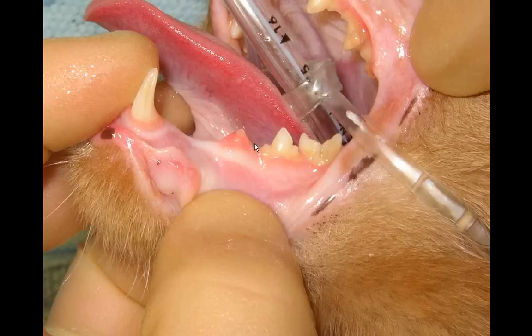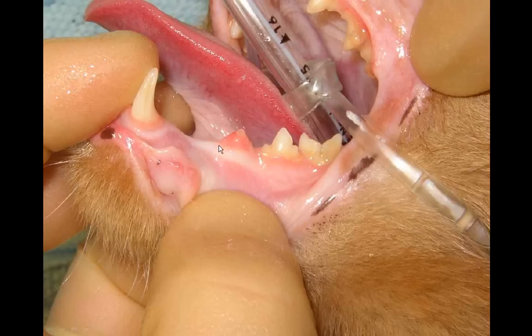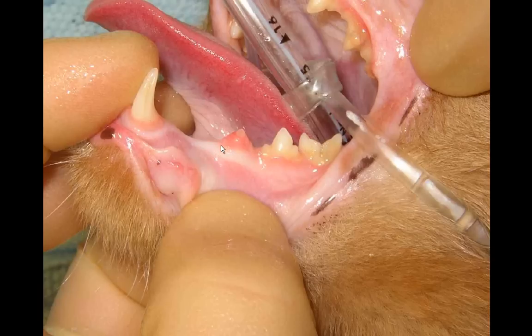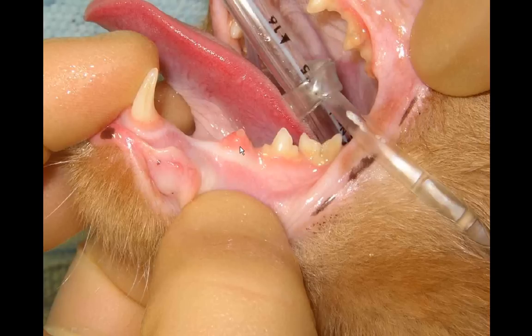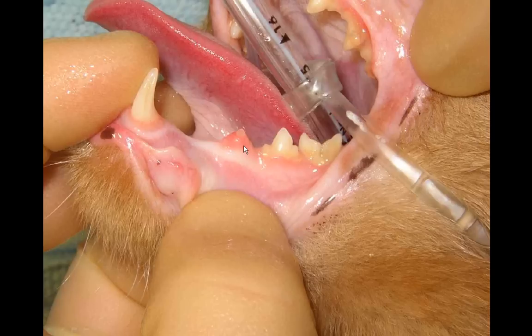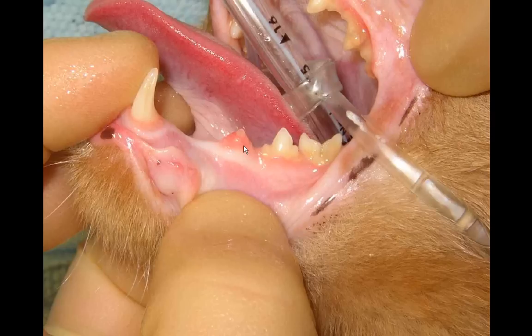Here's another cat that presents with — maybe at first you might think that's gingival hyperplasia or overgrown gums — but again, if you just gently touch that area with a Q-tip or a probe, you can elicit a chatter response on that cat.